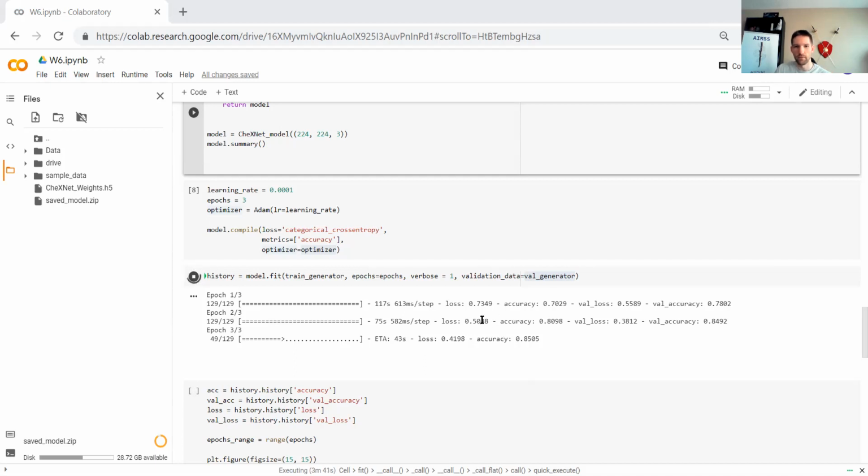And if you remember, when the training loss is going down but the validation loss is going up, that means you're overfitting. It's learning the training data way too well, to the point where it's picking up on unimportant signs that are very specific to the training set.